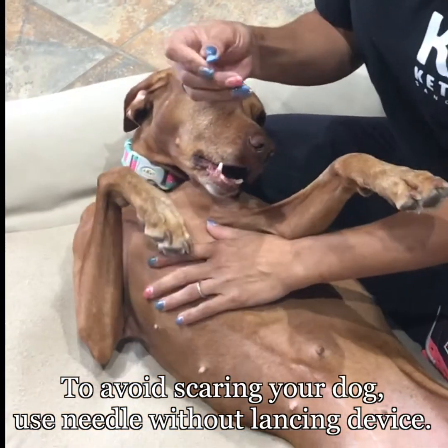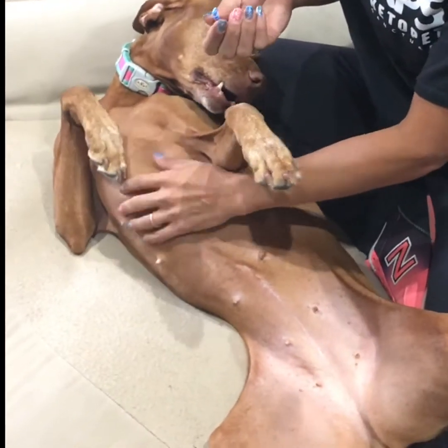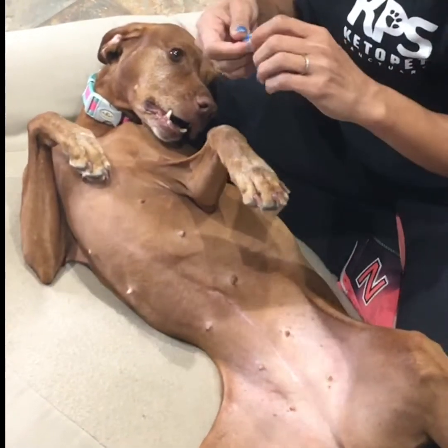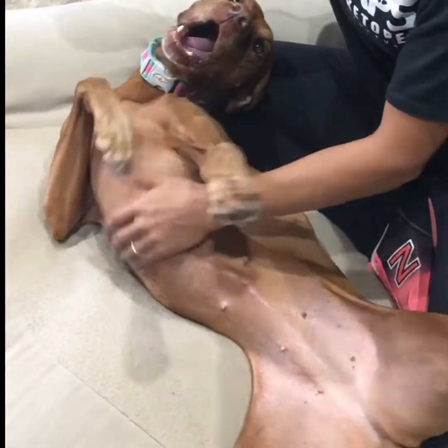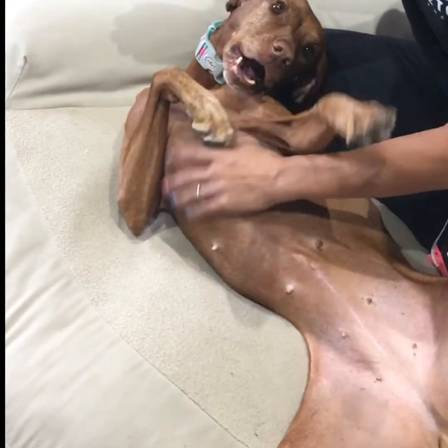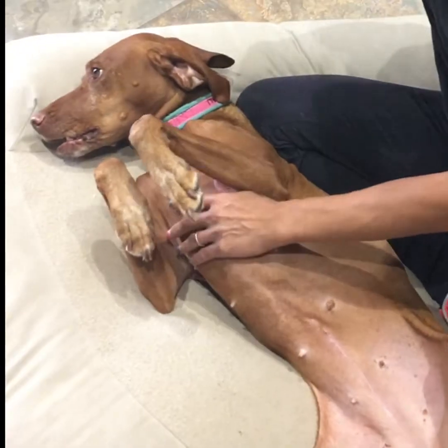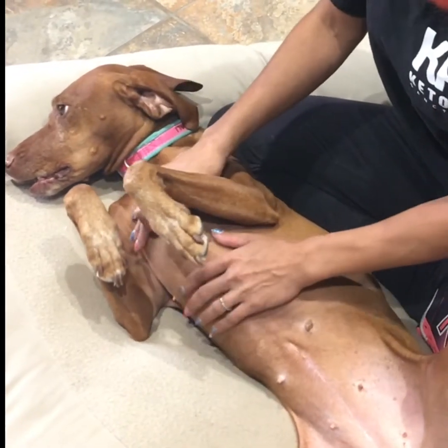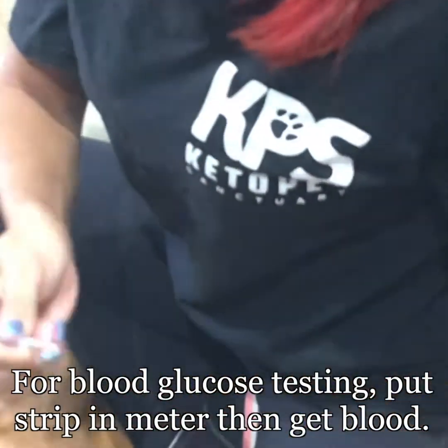I tell owners I don't like using the pen because the click tends to scare the dogs. I just take the cap off and poke the dog directly — those pens often keep you from getting as deep as you need to. Callie is a wiggle worm, so I figured owners could understand better with a wiggle worm since they're not used to getting it checked.